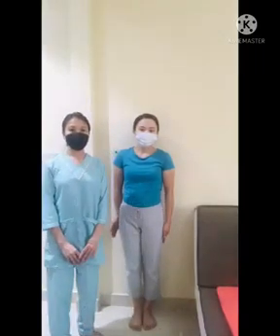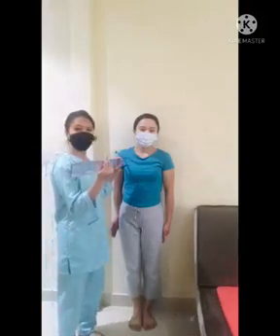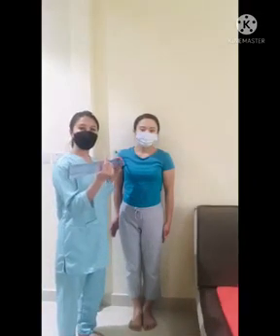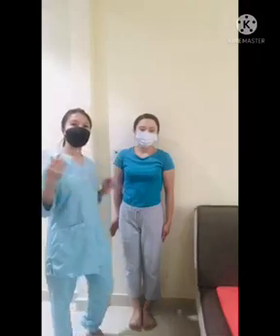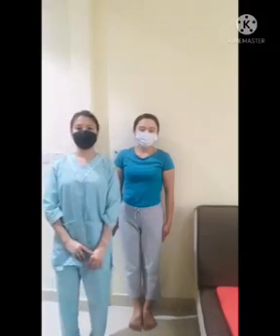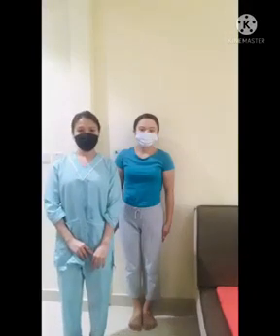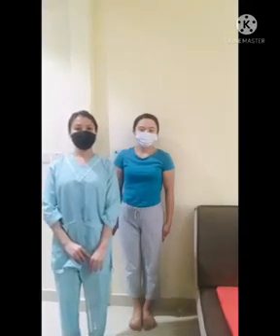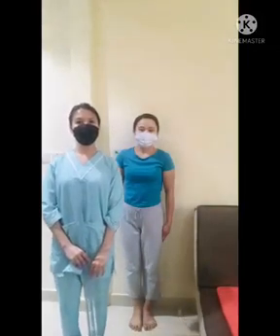So, the central ray in this projection is perpendicularly directed 1 inch distal to the coracoid process. The structure shown in this projection is the posterior part of the supraspinatus insertion. Both greater and lesser tubercles are often superimposed by the humeral head, proximal to our humerus.